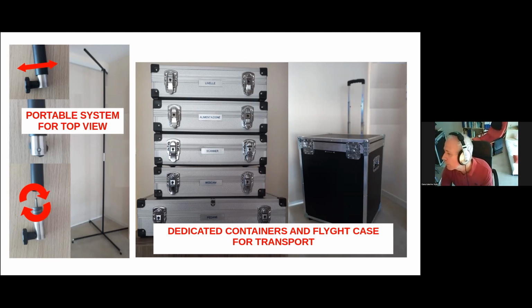Note that the support has 4 little feet that are orientable and adjustable in 2 planes of space. So the support is always stable on each type of floor you can find in another study or another place when you want to perform your analysis.